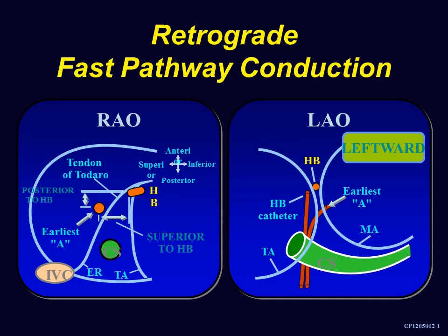The same thing is shown in LAO projection. I would spare the first 2.5 centimeters. And if you go around the 7 o'clock of the mitral annulus, some patients will have left atrial inputs which have to be ablated in this location, particularly patients with AV node reentry.